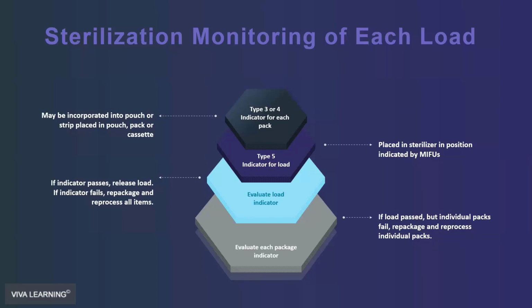So it's July 18th, sterilizer number 1. So that you know which instruments may need to be reprocessed if you had a failure. So thank you for asking that. I want to make sure that's clear, because I'm not saying that you don't need to date stamp your pouches.